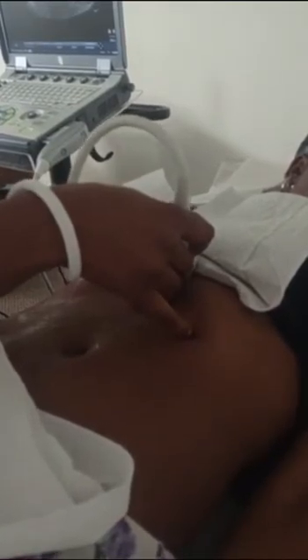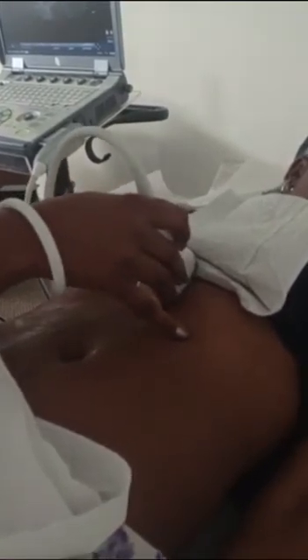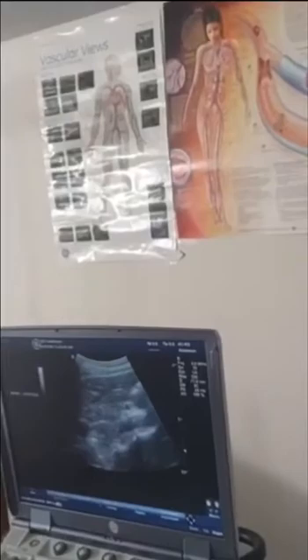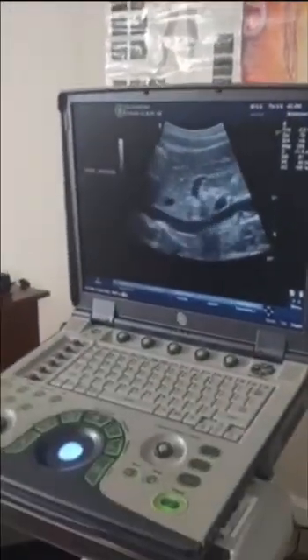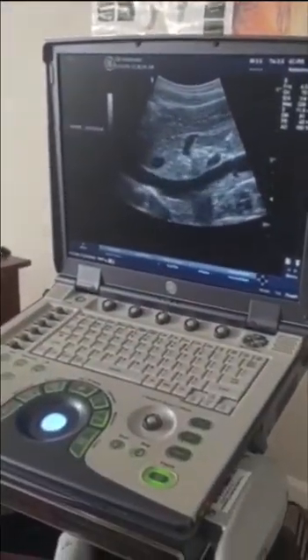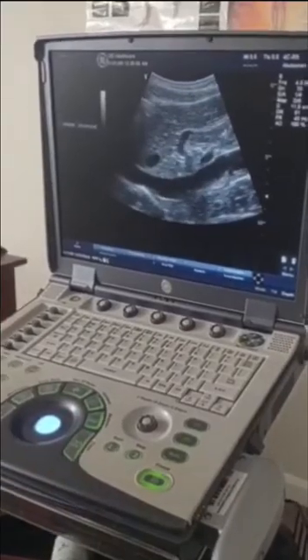So today I have a young model with me, and using the anterior approach, you can see your IVC as you angle towards the right of the patient. Your aorta is usually seen as you angle towards the left of the patient. I'm going to have them take a deep breath in and hold it, and you can see your IVC there.